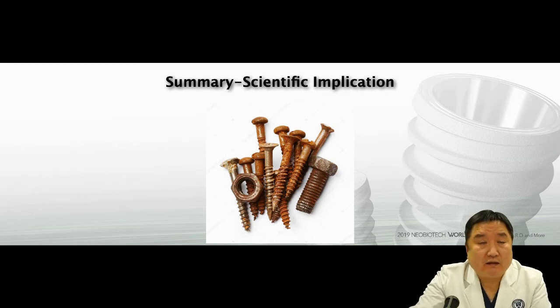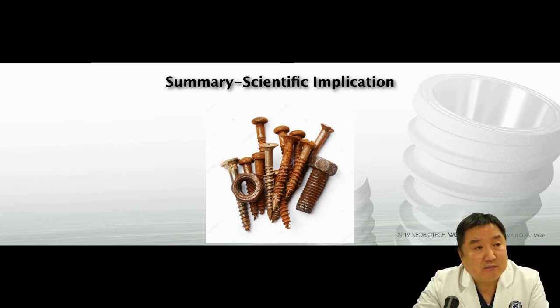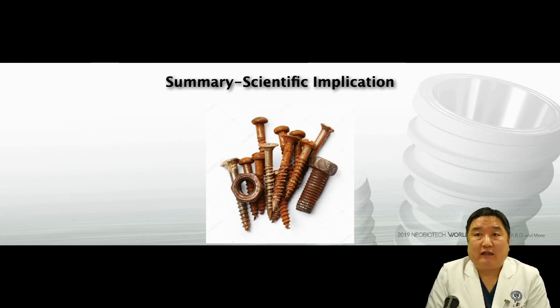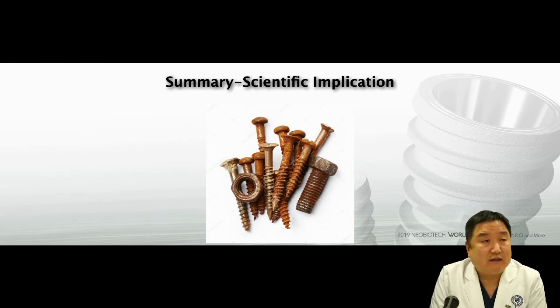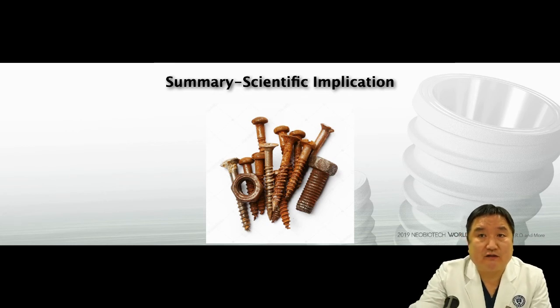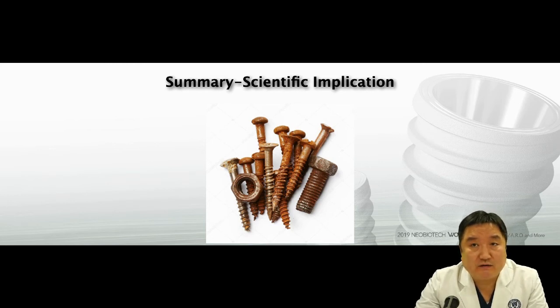We've kind of neglected the biological aging properties of dental implants, which means in all the studies that we have done so far, we didn't really consider biological aging of titanium implants. This aged titanium surface has never been standardized, and only very recently started to be described in several literatures in the field of dental research.